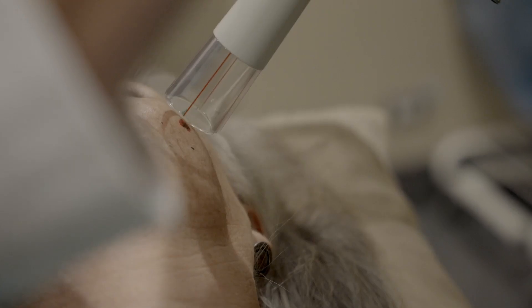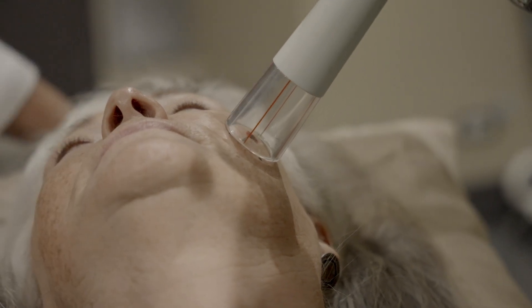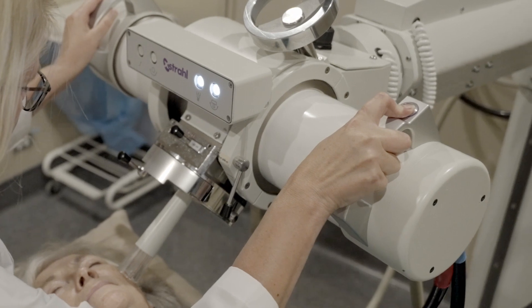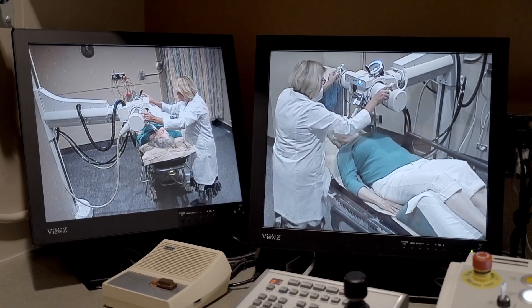For each treatment session, you will be set up in the same position you had on your first day. Your position will be recorded on your first day so the treatment staff can replicate it for each treatment. The markings on your skin will be used to recreate your treatment position. This may require a radiation therapist to move and adjust your position. We ask that you allow the radiation therapist to do the movement and try not to readjust yourself.